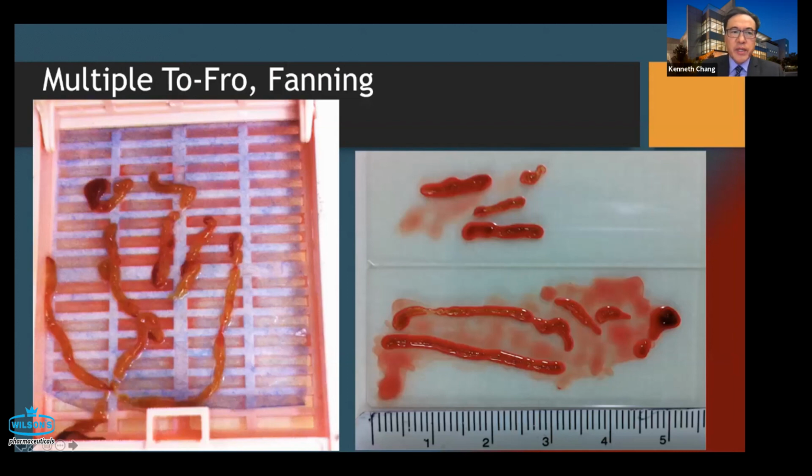Now, if we simply do a few more actuations, this is a demonstration of 3 actuations, and you can see we've got about 12 centimeters of liver tissue here. So you can get more and more liver by doing more actuations, and since it's only a single pass, you're actually violating the liver capsule once. So it's a very efficient, very safe procedure.